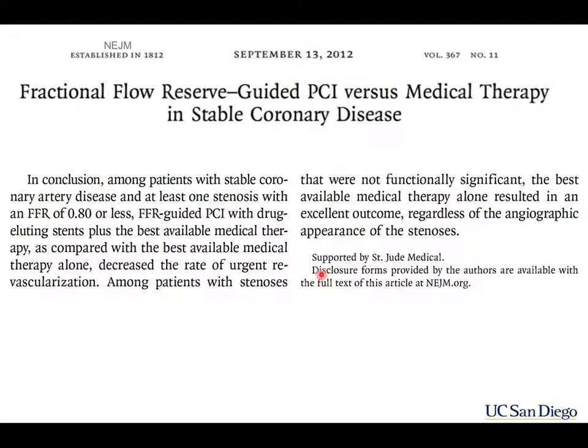This is it. It's FFR, called fractional flow reserve, and it's done in the cath lab with this catheter. And that is now the gold standard, right? Not quantitative angiography where you measure the geometry and decide that if it's greater than 70% stenosis, that patient is significant.